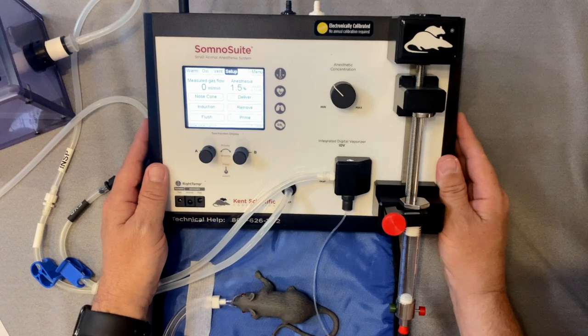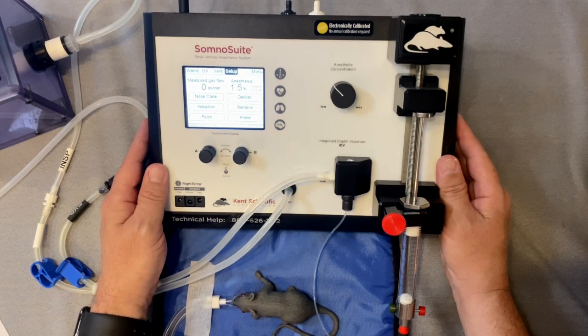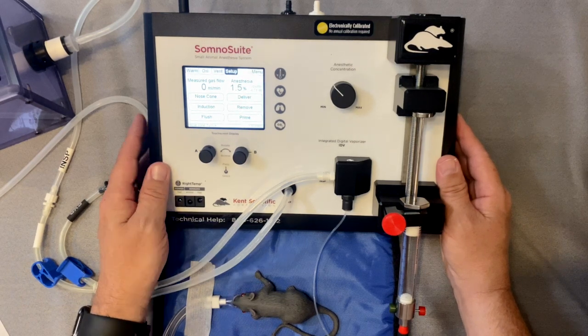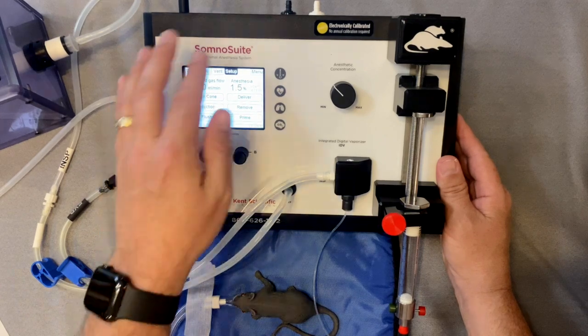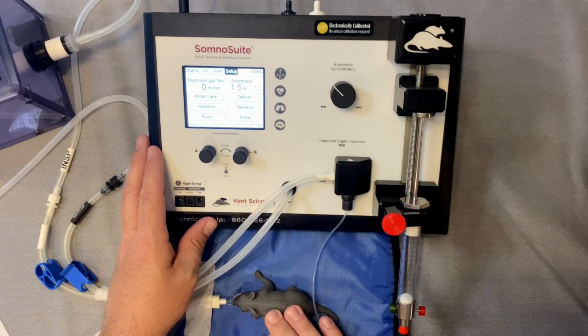Did you know you can deliver isoflurane by simply using room air? One of the most popular features of the SomnoSuite system is that it can deliver isoflurane using ambient air. You do not need a compressed gas source like you would with a traditional vaporizer. The SomnoSuite has an internal air compressor that draws in ambient air, mixes it with the isoflurane, and delivers it right to the animal.